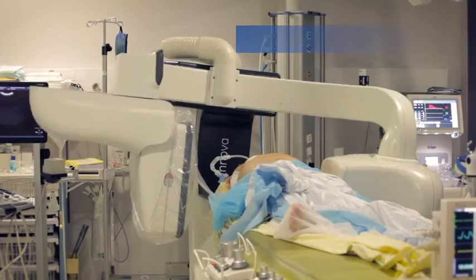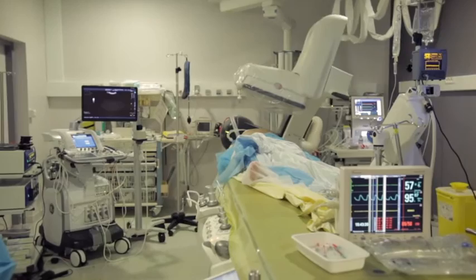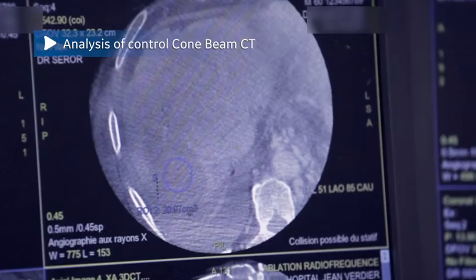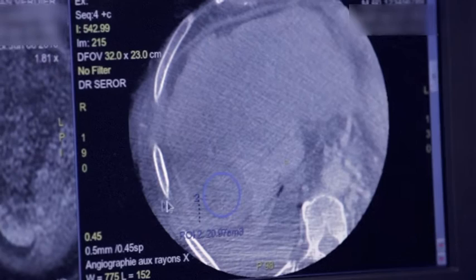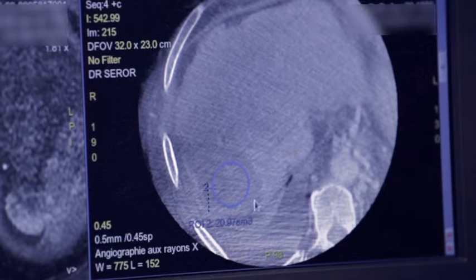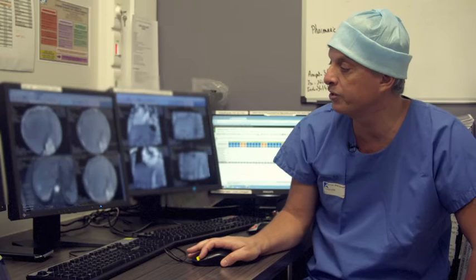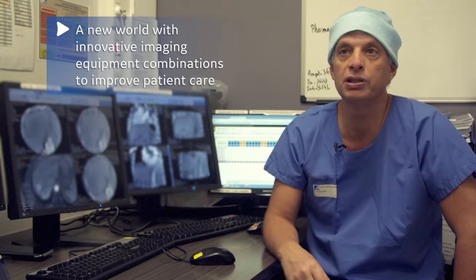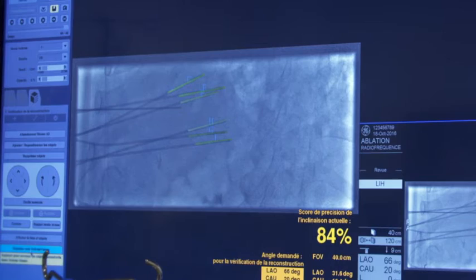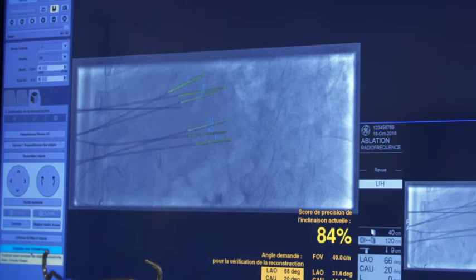After the ablation, we perform a cone beam CT in the portal phase to assess the thermal ablation margins. We are able to record again the contours of the tumor as we identified them in pre-therapeutic mode, notably with the MRI. You can see that this ablation area — this widespread hypodensity — circumscribes the former contours of the tumor. One of the electrodes was completely invisible, not identified by ultrasound on its own. By adding the cone beam CT and needle assist solutions, together with the Logic E9 platform with the 3D GPS marking tool, we were able to perform this ablation successfully.